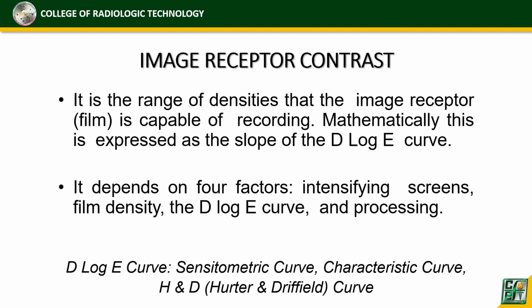Okay? So meron tinatawag na D-log E curve or sensitometric curve, also known as characteristic curve, or the H and D curve or Hurter and Driffield curve. So ano tong curve na to?